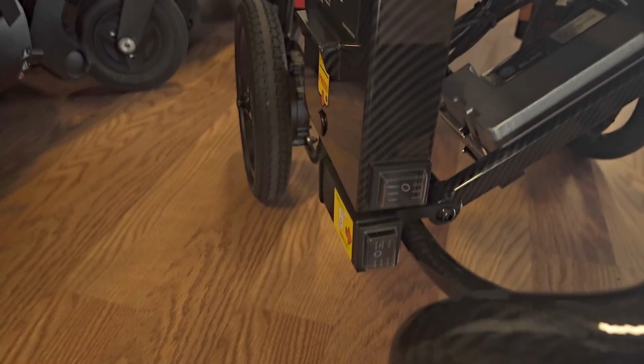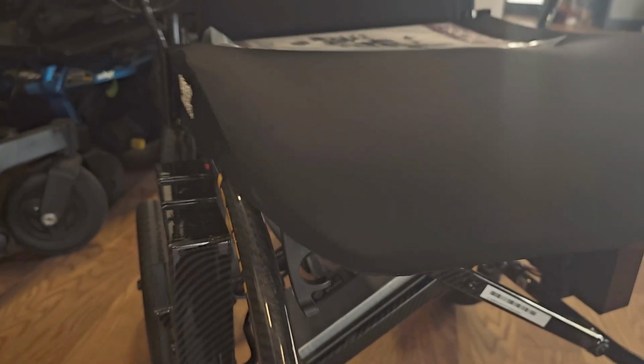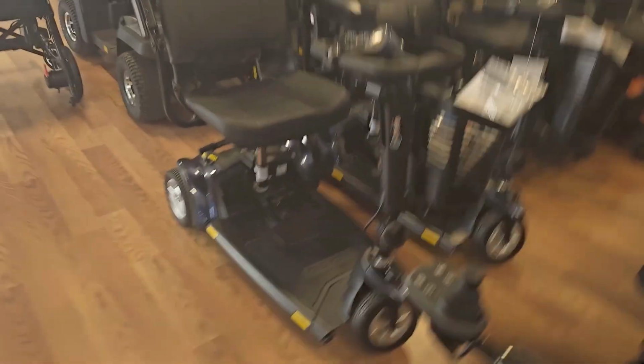We have a unit here. This is the Jazzy Carbon 27X. It does not have circuit breakers, but it has power on and off switches. So there could be multiple reasons why these don't power on. I do want to show you one more thing. So that concludes the circuit breaker. But this is another thing that could happen.